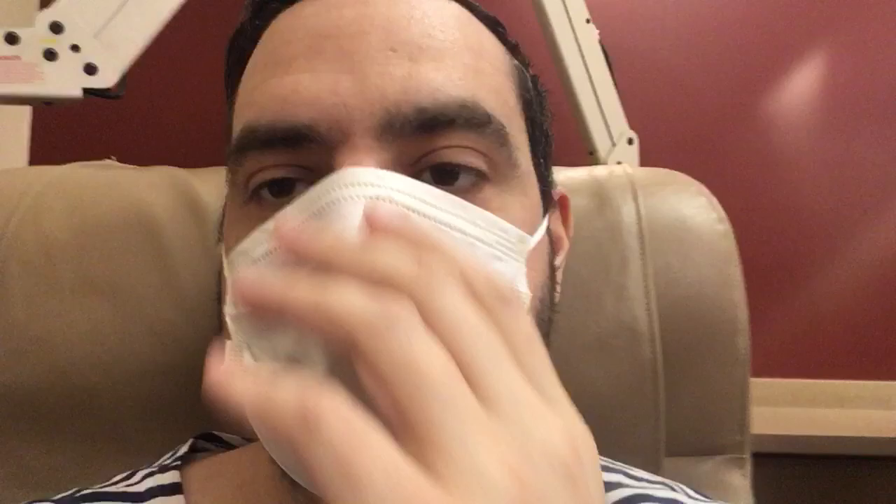My mask is on and we're about to hook me up to the dialysis machine through my port, which is right here. I'm going to pull this out for ready access — you'll see what that is in just a second.